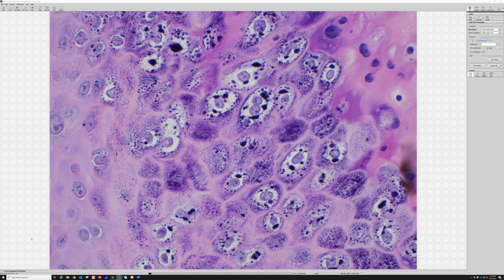There are some similarities, like that halo effect, but I think they look very characteristic on PAPs, but don't expect koilocytes to look like that in the skin in a verruca vulgaris. I'm not sure if it's because of the difference between the HPV subtypes, or because this is HPV growing on dry skin rather than on a mucosal site, or some combination of those.